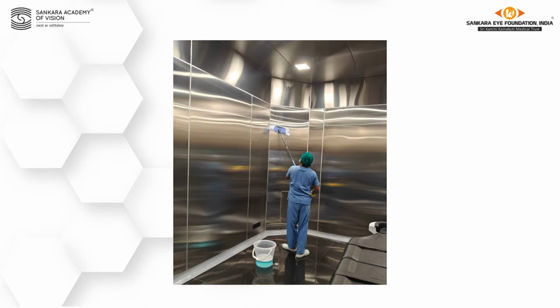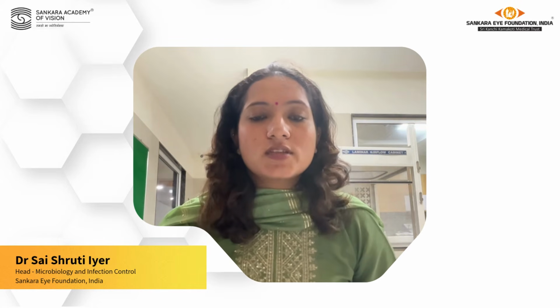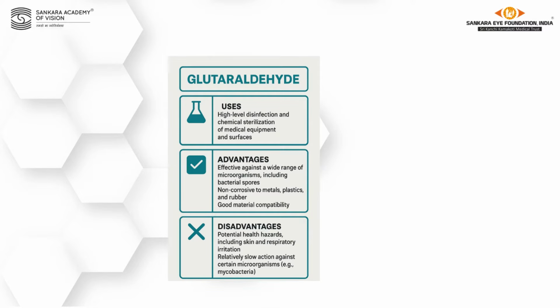Cleaning has a major role to play in maintaining the sterility of the OT. What are the factors that we should keep in mind to ensure a good cleaning process? Number one is the right product. Glutaraldehyde is a very good terminal disinfectant and achieves good bactericidal activity. It is apt to be used in critical areas like the operating room.